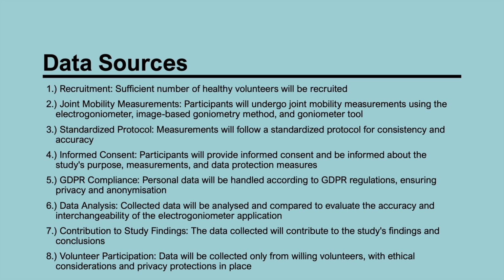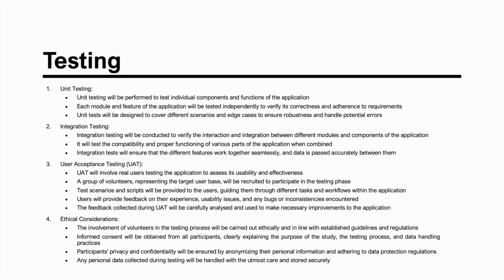GDPR compliance: personal data will be handled according to the GDPR regulations, ensuring privacy and anonymization. Data analysis: collected data will be analyzed and compared to evaluate the accuracy and interchangeability of the electric goniometer application, and contribute to the study's findings and conclusions. And volunteer participation: the data will be collected only from willing volunteers with ethical considerations and privacy protections in place under the University of Liverpool rules.